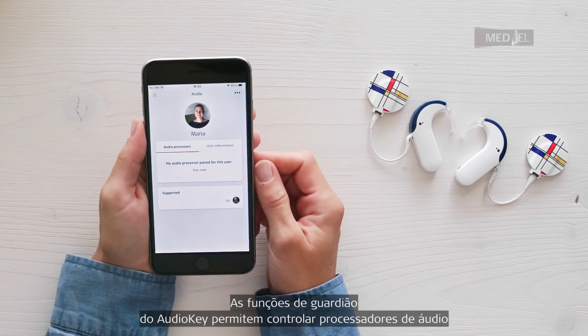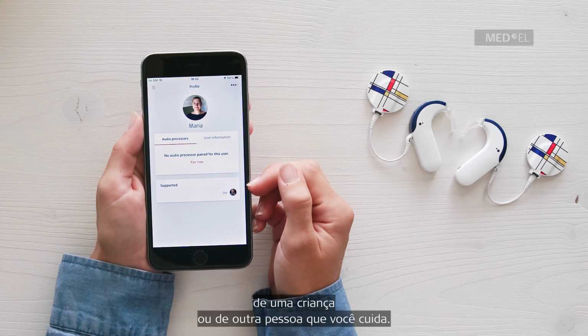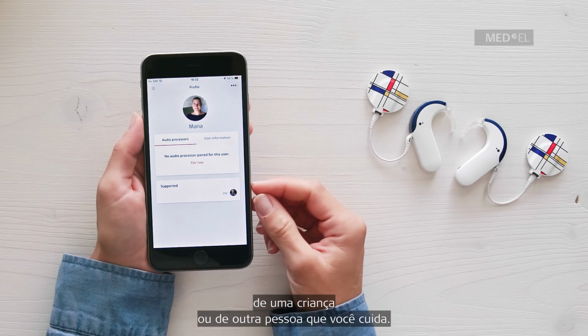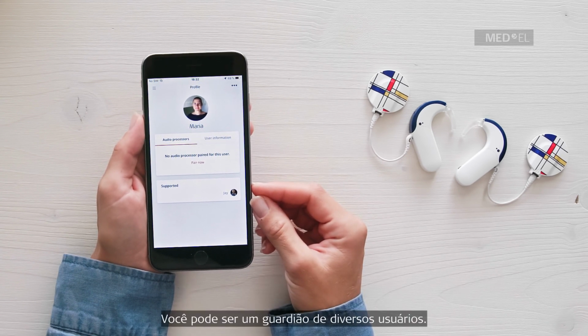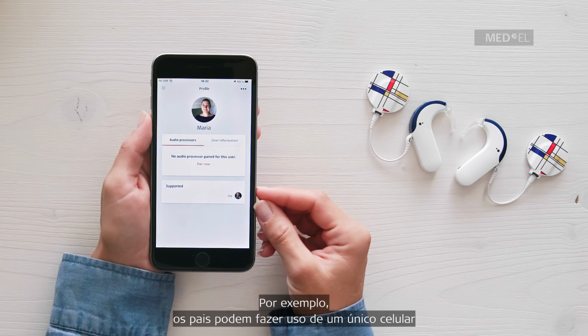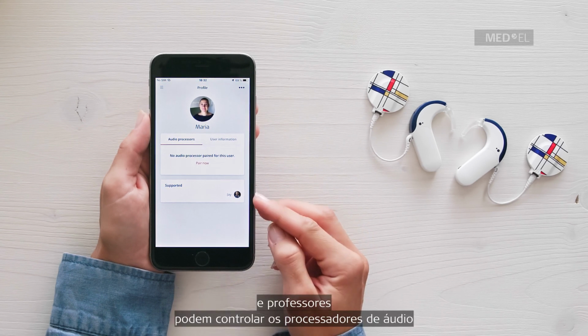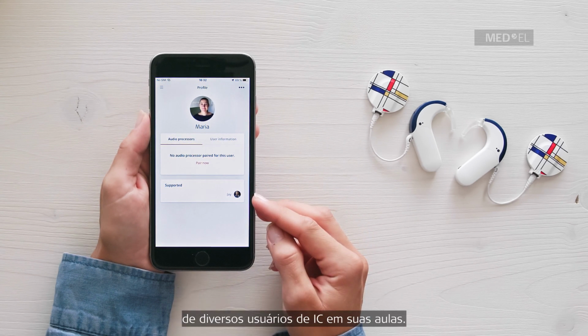AudioKey's Guardian roles allow you to control audio processors belonging to your child or another person you look after. You can be a guardian for multiple users. For example, parents can use a single phone to control the audio processors of all their children, and teachers can control the audio processors of multiple CI users in their class.